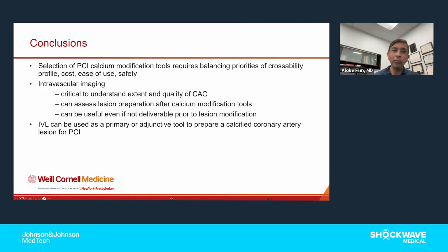We showed in this previous paper I just presented that OCT probably missed more than 50% of fractures. Fractures were present, but they weren't distinguishable on OCT. So I think imaging has its limitations. Which modality is better will be answered by this specific study we're doing.